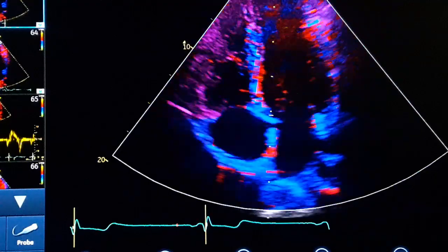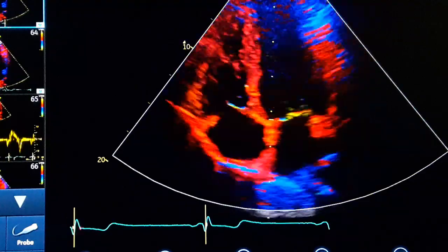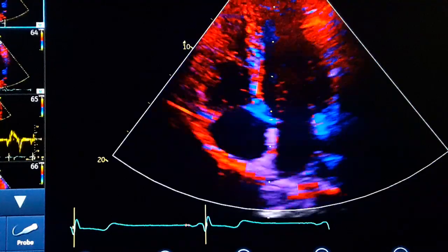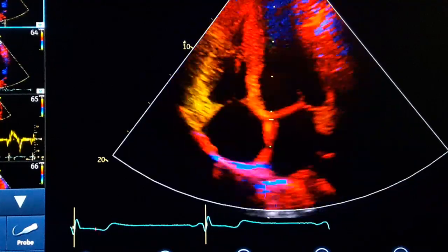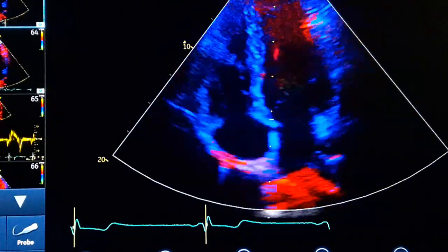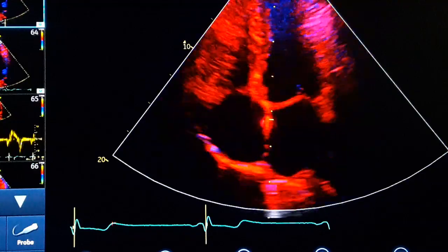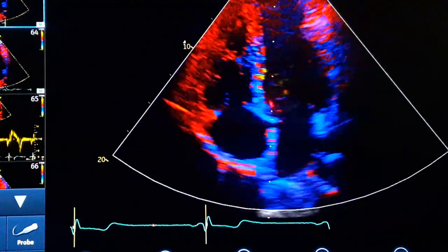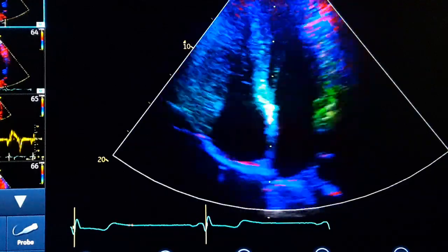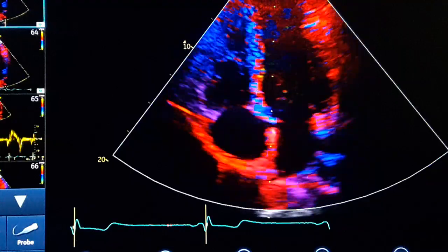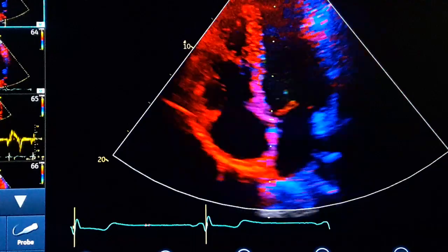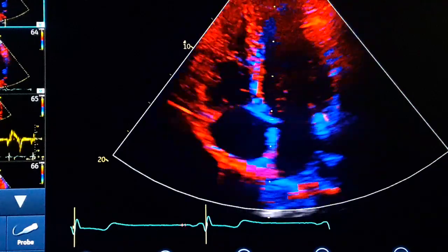One of the most important things in this case, you have to make sure that your cursor is almost parallel to the movement of the annulus of the heart. As you see here, this annulus movement goes almost parallel to the cursor, so I am in the right place and right view. If it's not, with heel-toe adjustment you can align this movement and cursor on the same line, even for the lateral annulus.